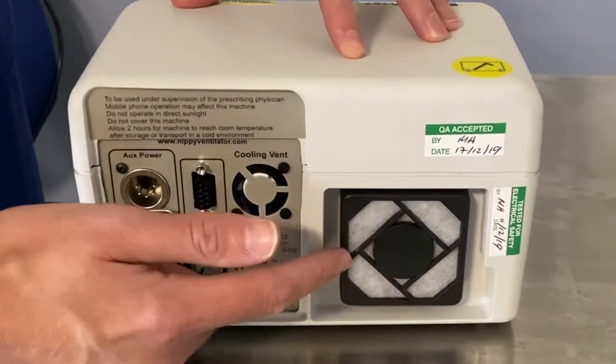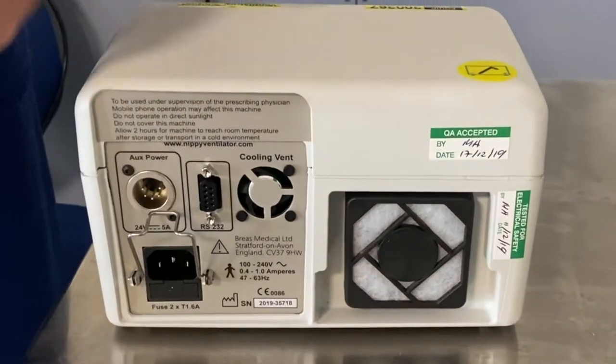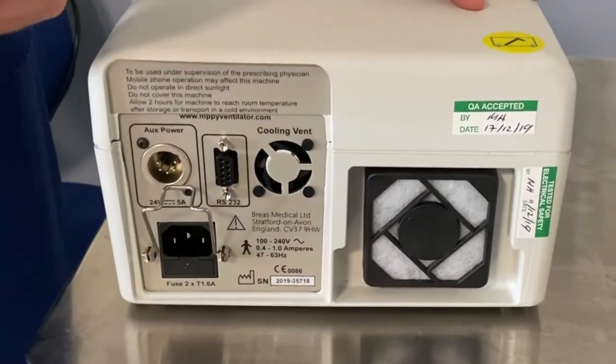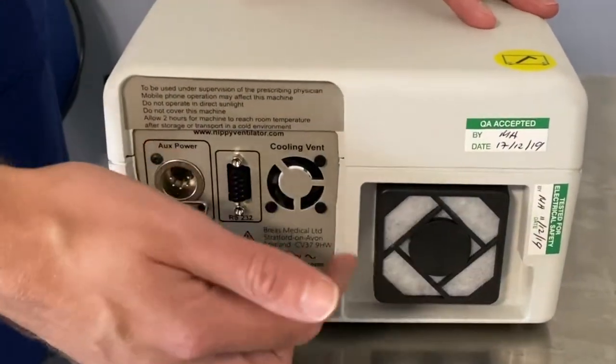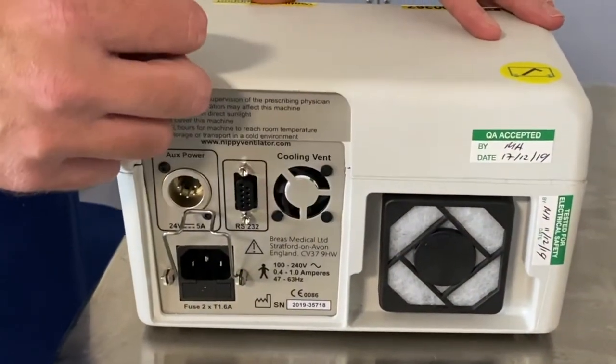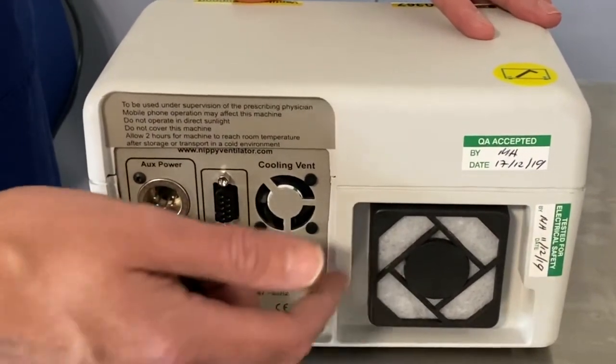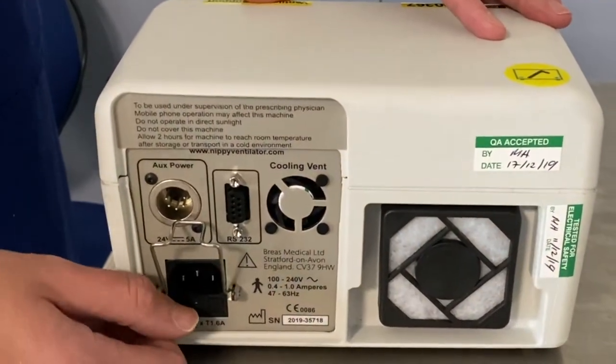There's a filter. Inside the machine there is a turbine which generates a flow of air. Depending upon what settings we set your ventilator to will depend upon how much air is blown out of the machine. What this filter does is it protects that fan and the inner workings of the device from any dust that might be in the atmosphere.